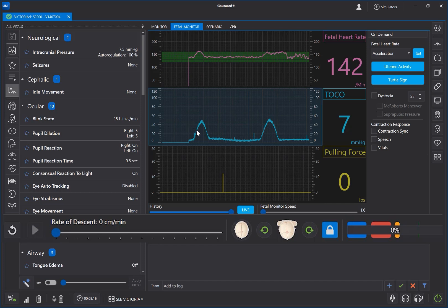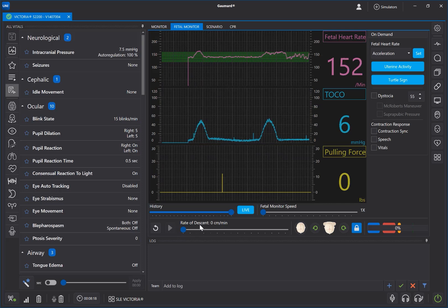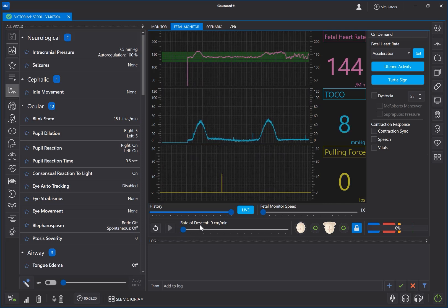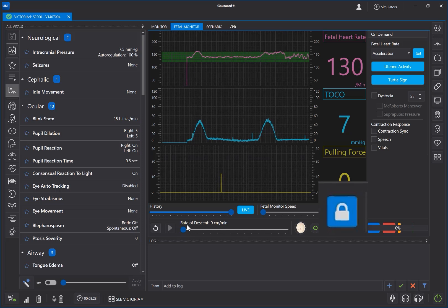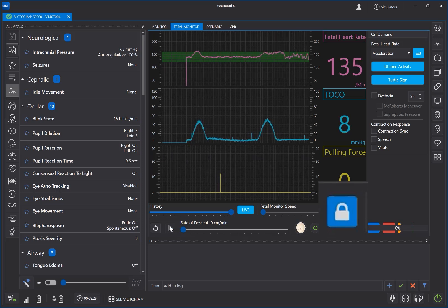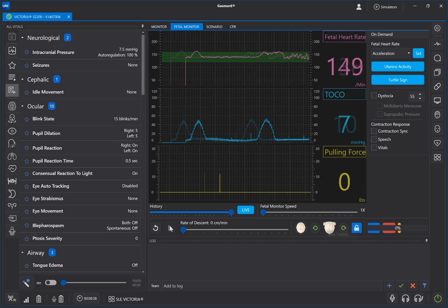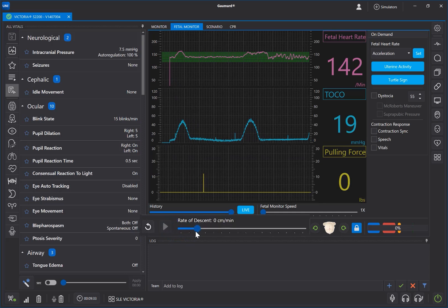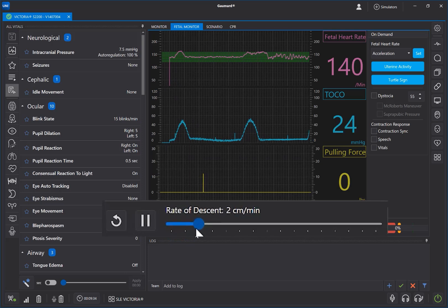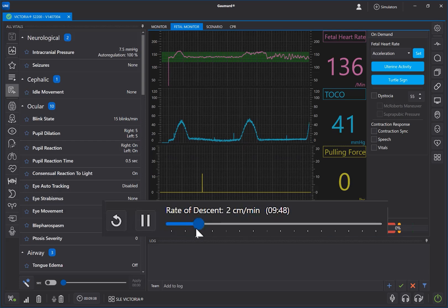To begin a labor, first set up the fetus in your Victoria or Noel simulator and confirm the baby is connected, as indicated by the lock icon — it will turn blue when the baby is on and communicating. To start the fetal descent, move the rate of descent slider to the desired speed. An estimated time until delivery will be shown above.